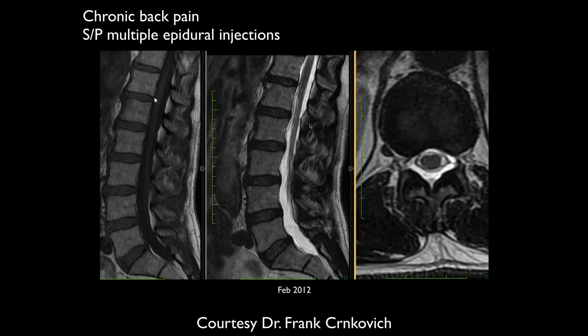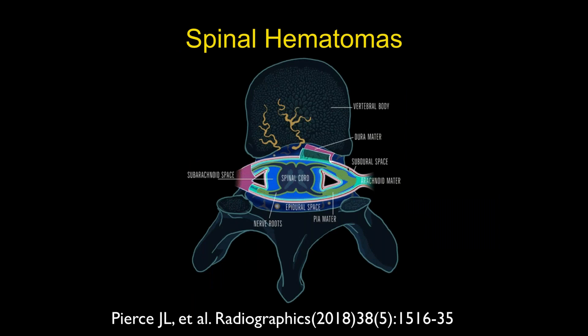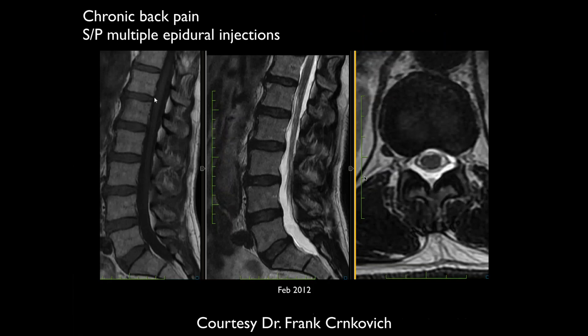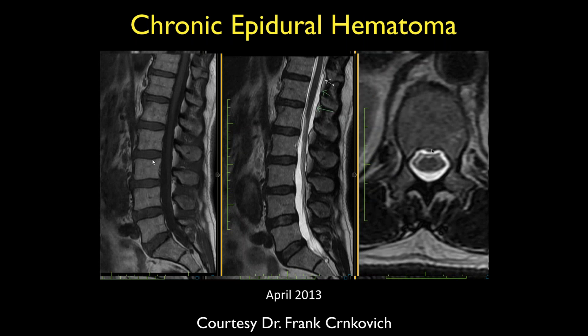On the sagittals it just looks like normal CSF — you wouldn't call it abnormal. But on the axials it is abnormal: there's something epidural here. The dura is normally not visible, but the epidural collection has pushed it away from the bone, allowing us to see the dura and the subdural space. All this anatomy is now visualized because the epidural collection has pushed it away from the bone. You can see the entire thecal sac is surrounded by this fluid.